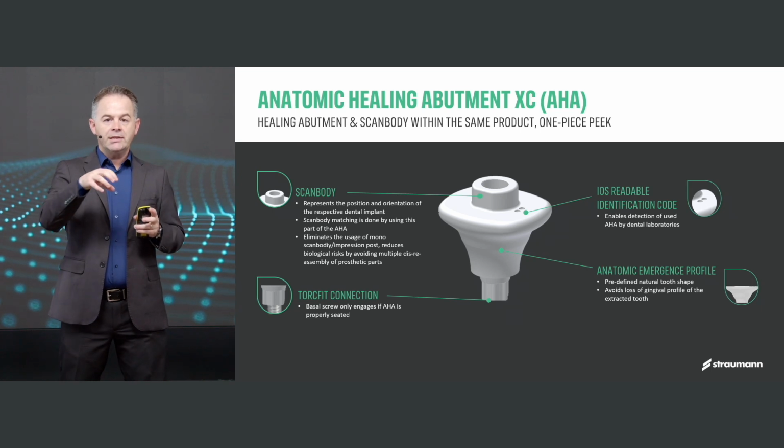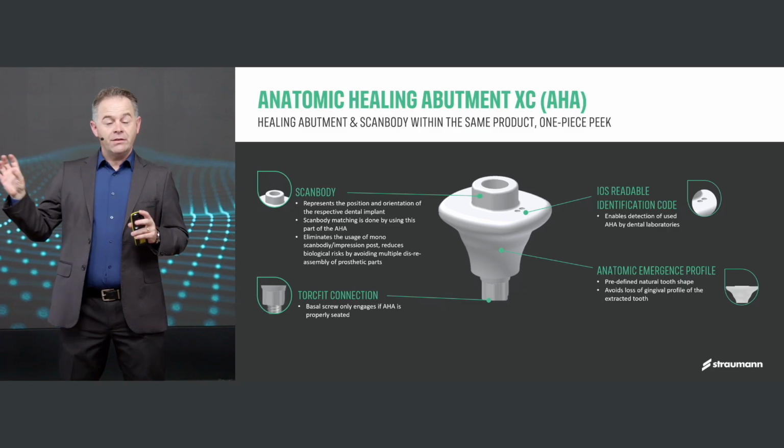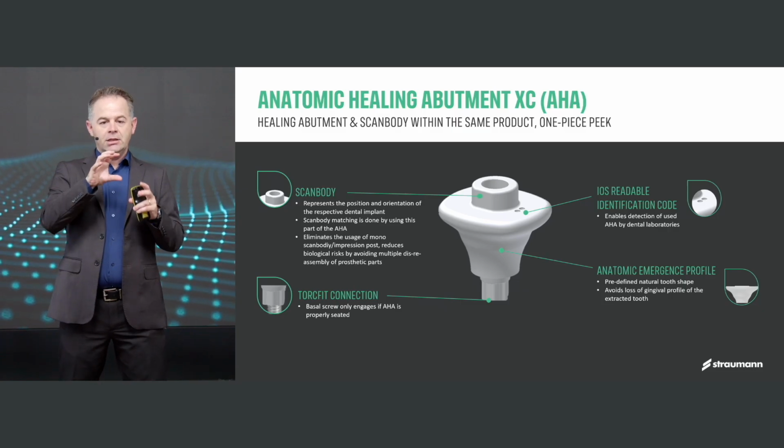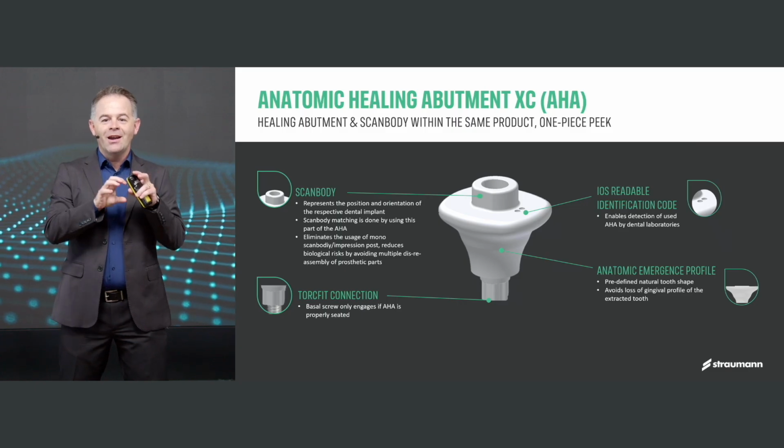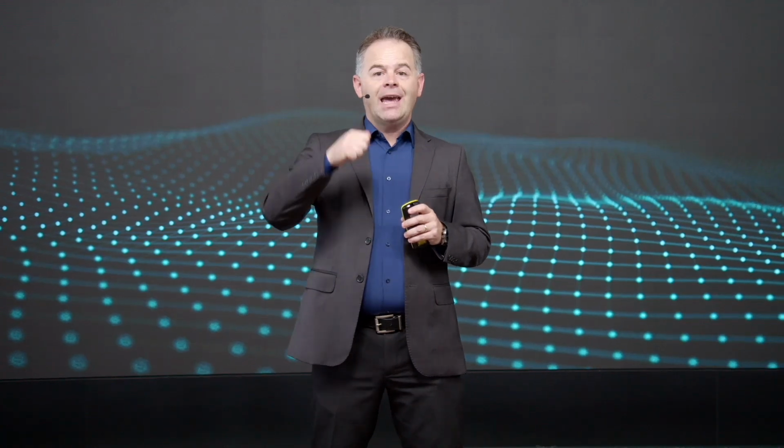So once you place it, your soft tissue will heal all around this. And when you transfer this information to the lab, it's just like replacing the wheel of a car because the shape is pretty much the same. The other advantage is the scannable head.